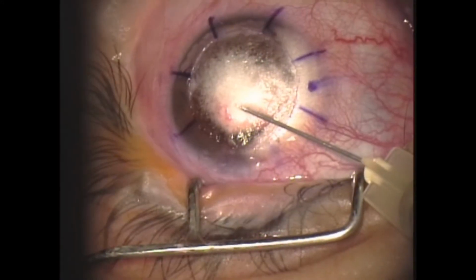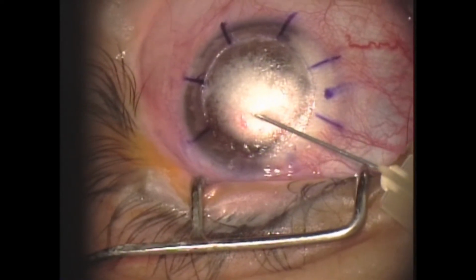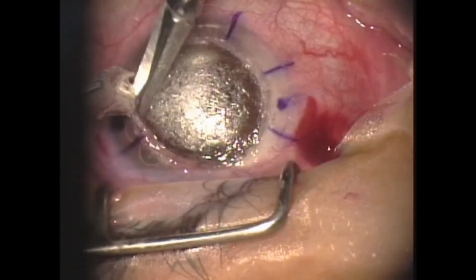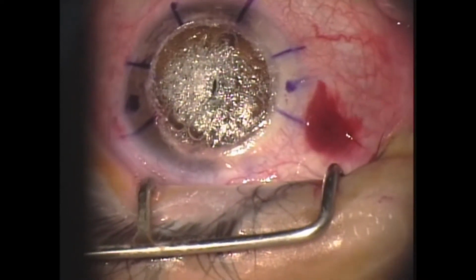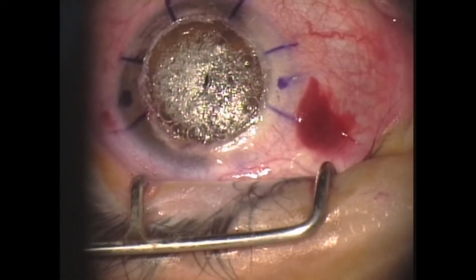In this other case, we can clearly see the formation of a peripheric bubble, which indicates it's a big bubble type 2. After keratectomies were performed, now it's time to puncture the big bubble. This may be considered one of the most risky steps in the surgery, because of the probabilities of an accidental central perforation. Luckily, that didn't happen here.